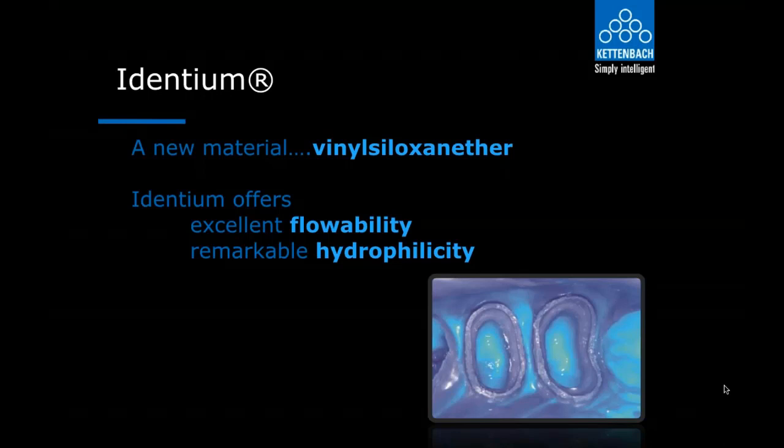What brand of soft tissue laser do you use for sulcular prep? There are a lot of great lasers out there, and for me to say one's better than another, I would not do that. There are a lot of great diode soft tissue lasers out there. The beauty of a laser is that a lot of people think of electrosurge, but it's not. Remember, when you laser something, it heals immediately.